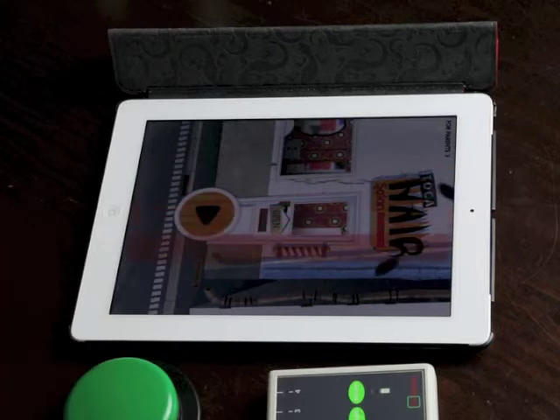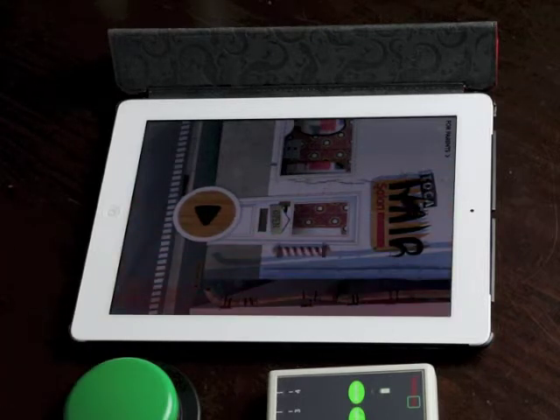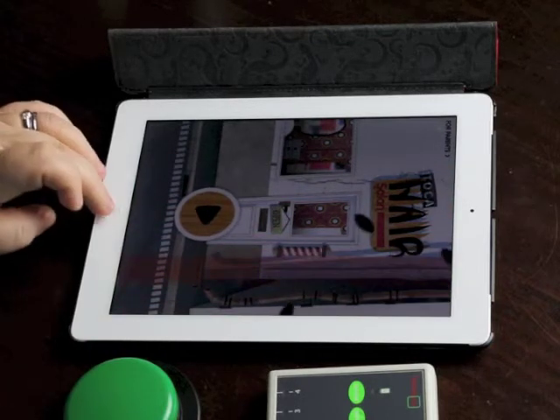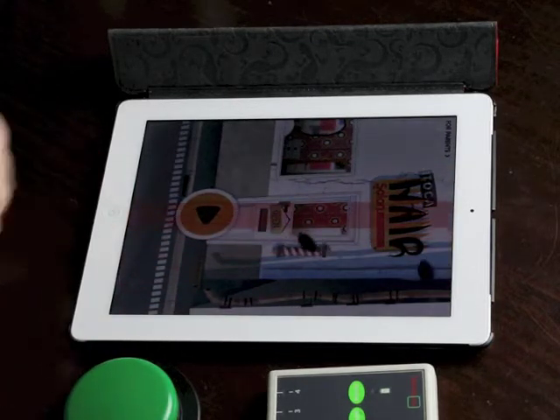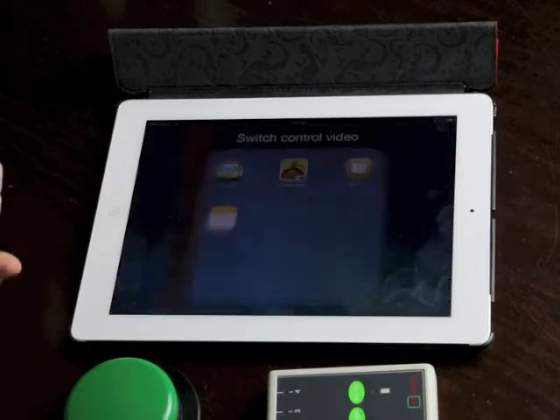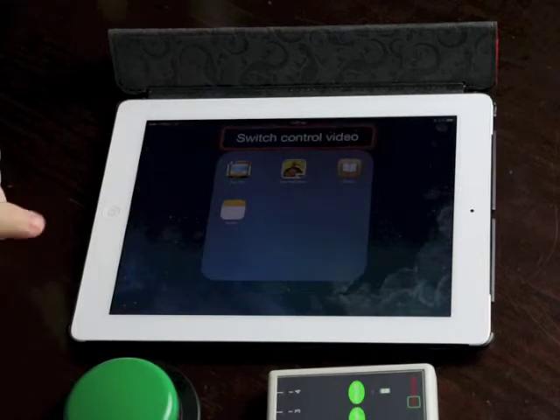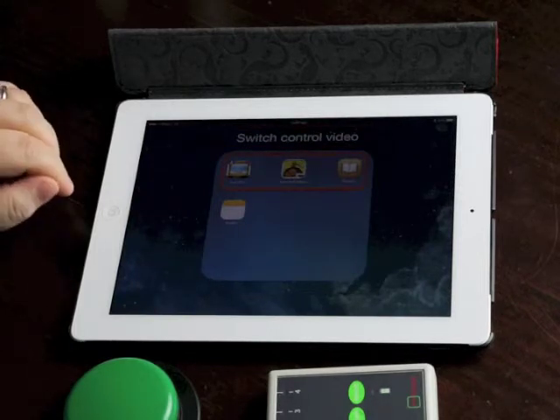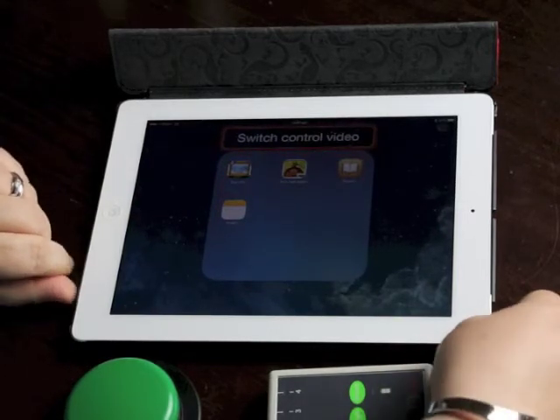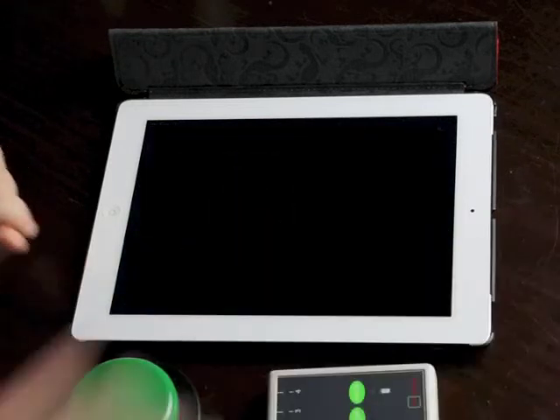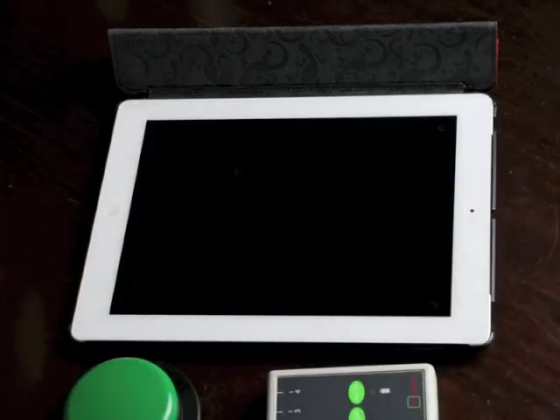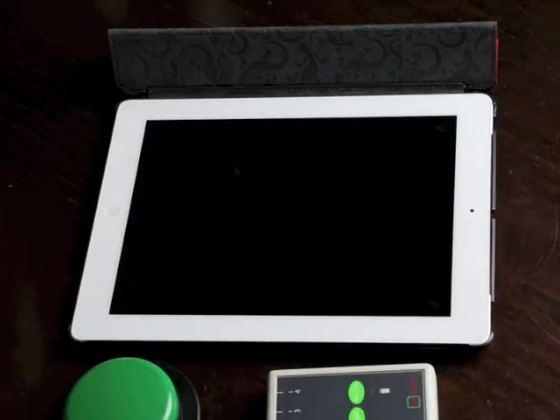So auditory scanning is going to have the most limitations. So that's switch control with a single switch. I hope that that was helpful, and I'll be doing a further video on two switch control soon.